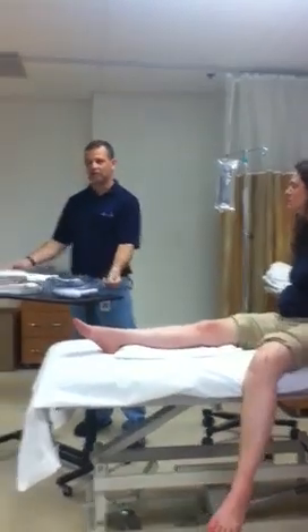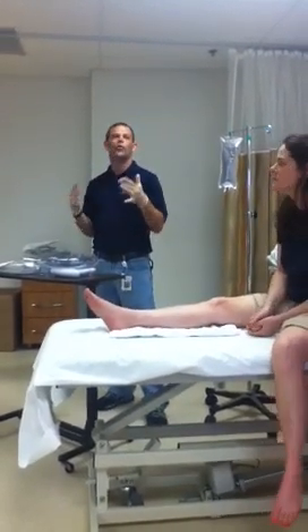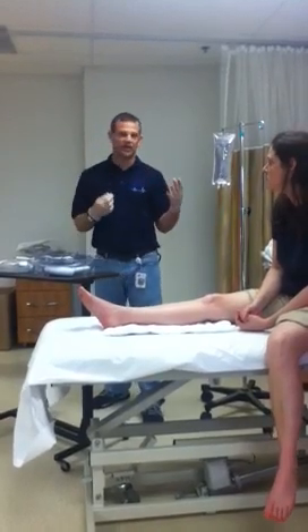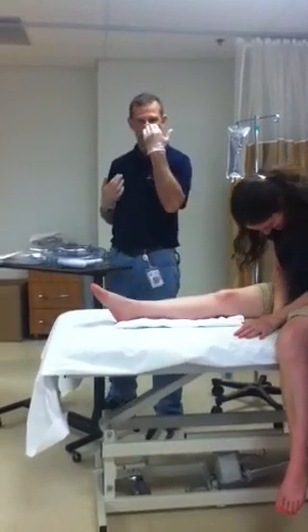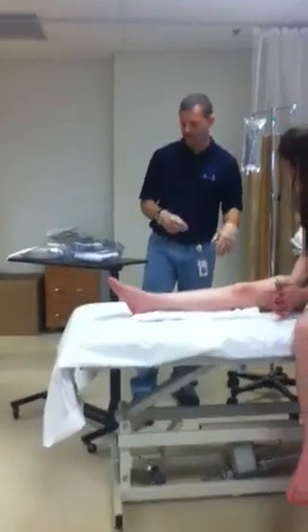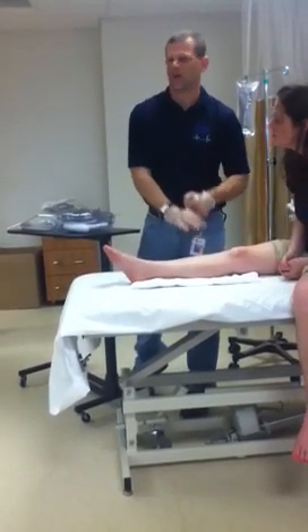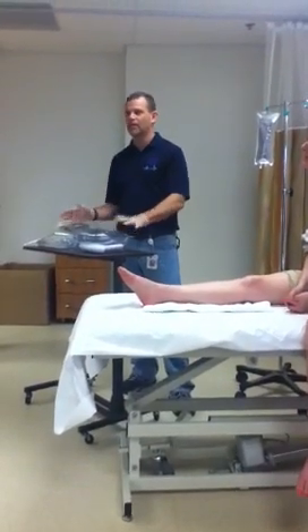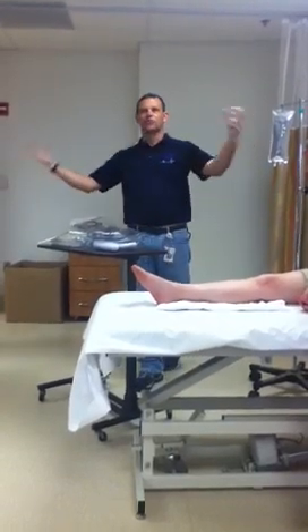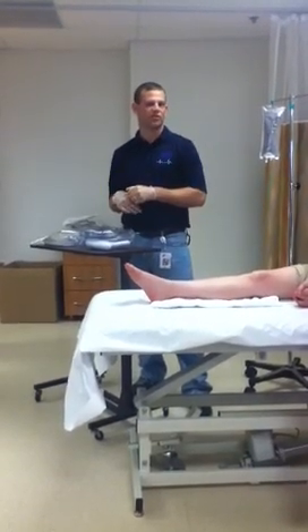I'm going to pull this open. I have not put on a gown today so that you can see me. I am wearing a mask and eye protection because when I get good at this I may not have to, but there's always a chance that something's going to bounce up — do I really want anything coming out of her wound bouncing up into my eye? Some of these actually come with a clear plastic shield you can throw over and stick the thing through, greatly reducing splash-back. One of the other companies actually comes with a big plastic wrapper with a little hole in it — you throw that on there and you don't have to wear as much protective gear.